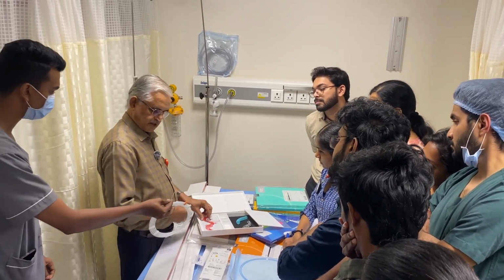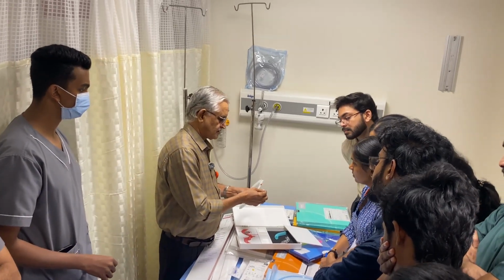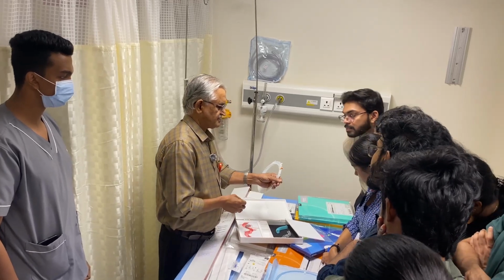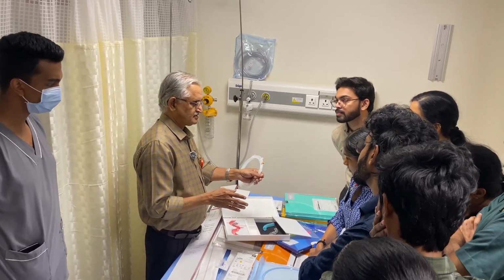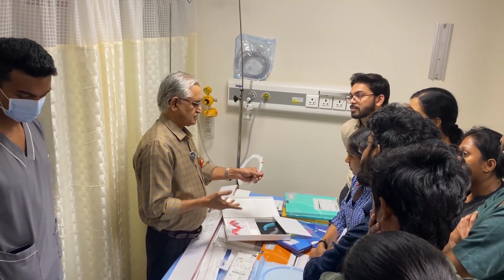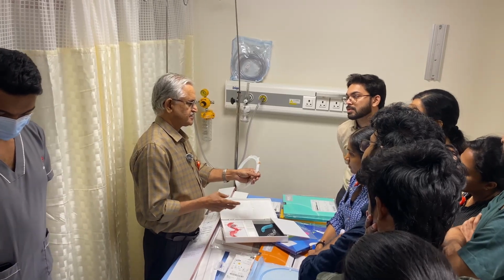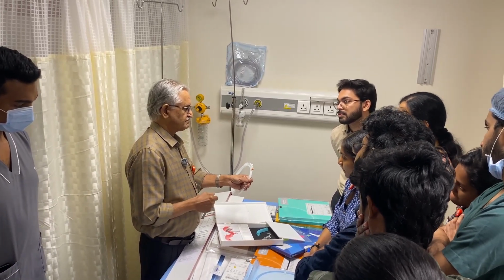This is an example of a coil. Coils are very fine and soft, and generally made of 4 or 5 types of metal; generally it's an alloy. Nitinol is one, tungsten is one, iridium is one, and chromium.